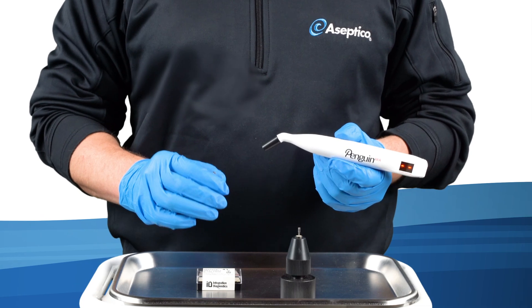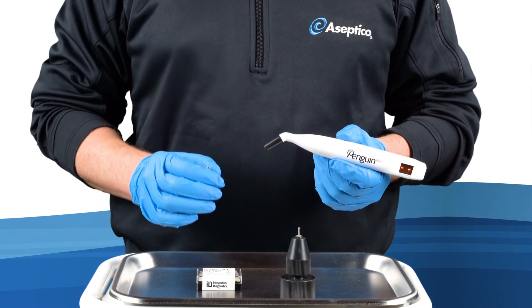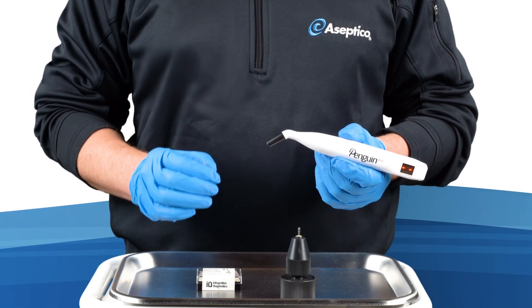It is advisable to take at least two measurements — buccal and lingual. There is an associated multi-peg for most popular titanium and ceramic implant brands and platforms.